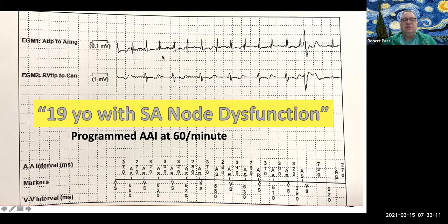And I think you could make the argument that if this is sinus tachycardia, which it certainly could be in a 19-year-old, heart rate of 170, 180, then this patient's probably not programmed properly, right? Because they can't conduct at 170. Now, if they were a Fontan patient, it would be unusual to have a heart rate this fast in the atrium.